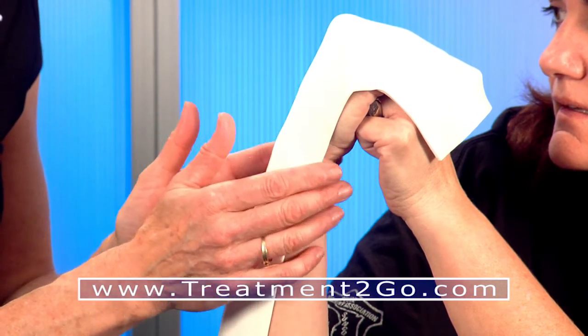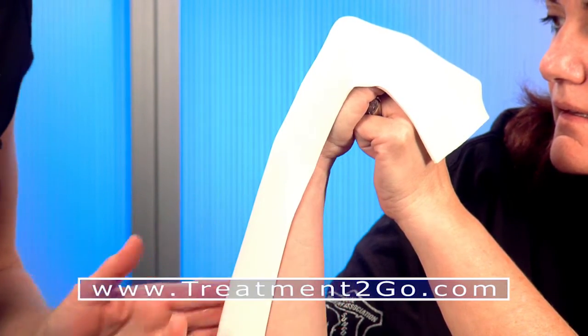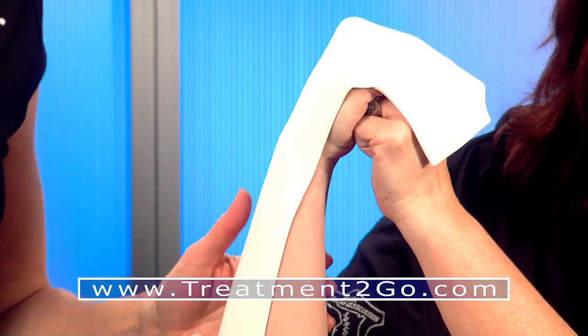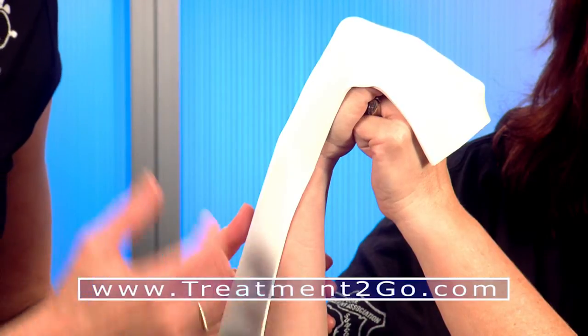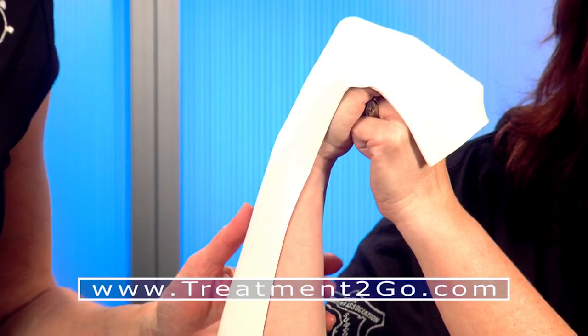You can get this material in a perforated version. It's going to go over the back of the hand, probably over some dressings. This is a great coated material, very easy to work with, and has excellent memory. So if you do make a mistake, you can take the material and throw it right back into the hot water to redo.